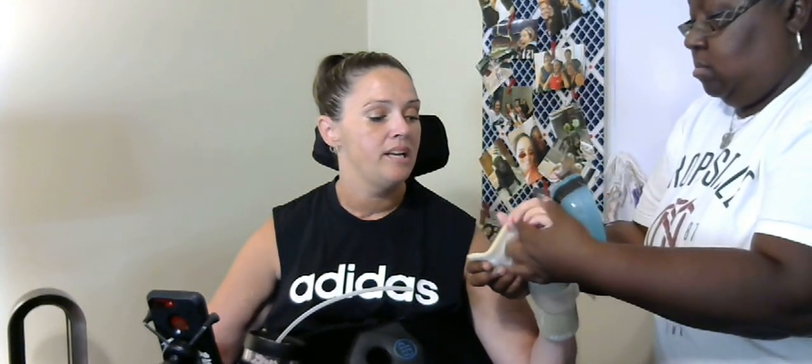It's got some Gorilla Tape on it, and I have just taped it to a piece of Velcro. Right now Tiffany is securing that piece of Velcro around my hand. Just because of the way that my hands are facing, this is the one that's most convenient for me. If you were to put food in the back of the bowl, such as popcorn or chips or candy even, I can eat the food out of the bowl.